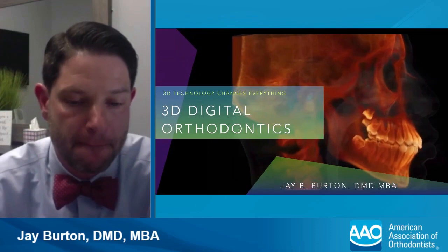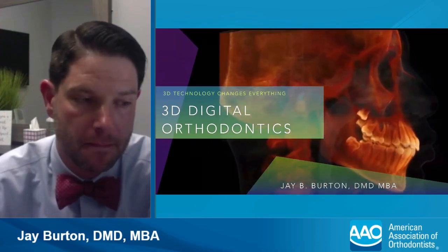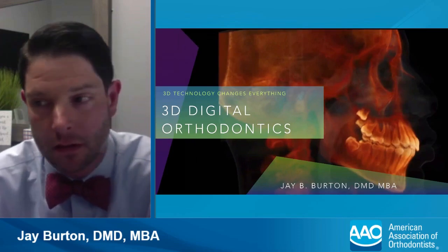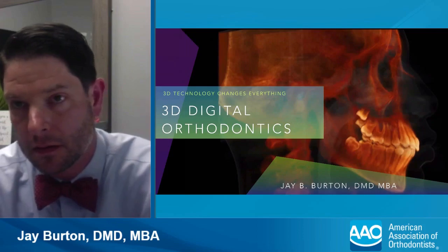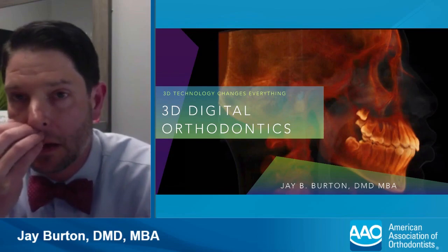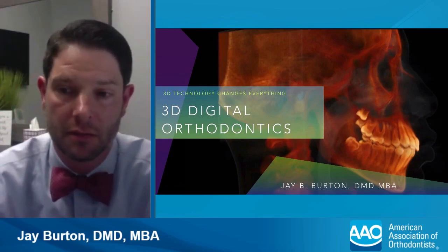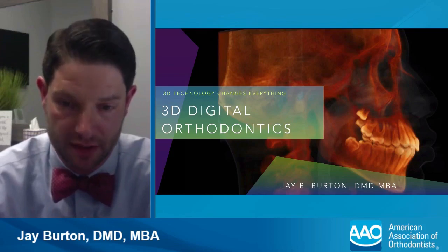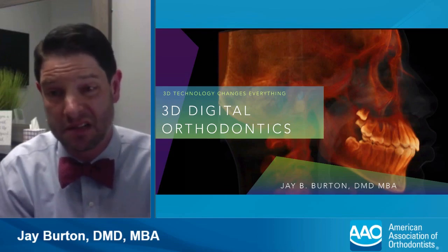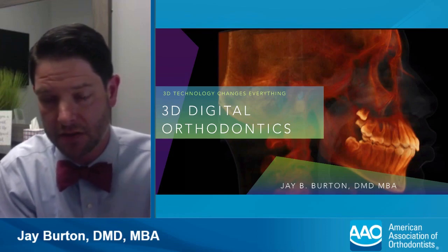Somebody asked what the first year that ULD was available was, and how do we compare that to our current 3D, and is it worth the upgrade for a change in radiation? I just confirmed that ULD was introduced by Planmeca in 2014, but maybe you could speak to the changes in radiation. I think that's going to have to be a personal decision for that orthodontist. For me, my practice is made up of about 75% kids, and so radiation dose is very important.